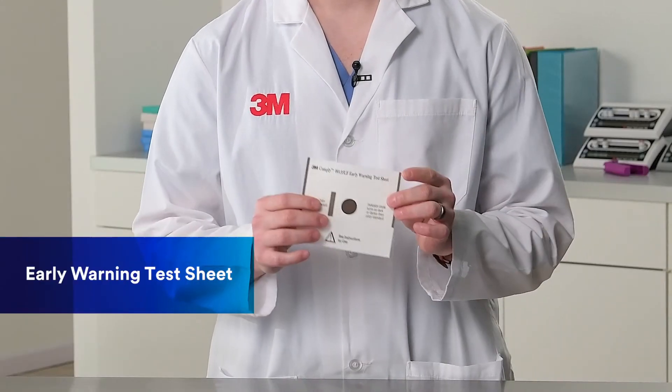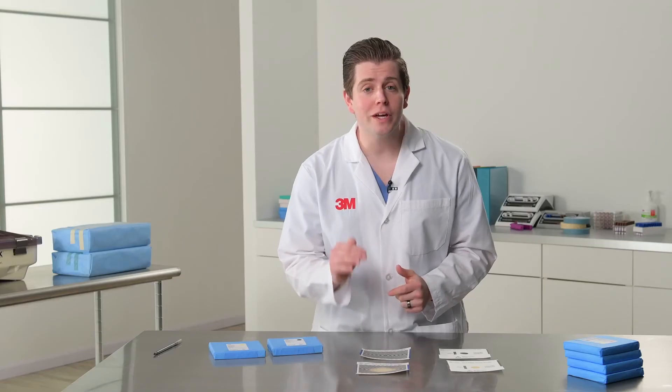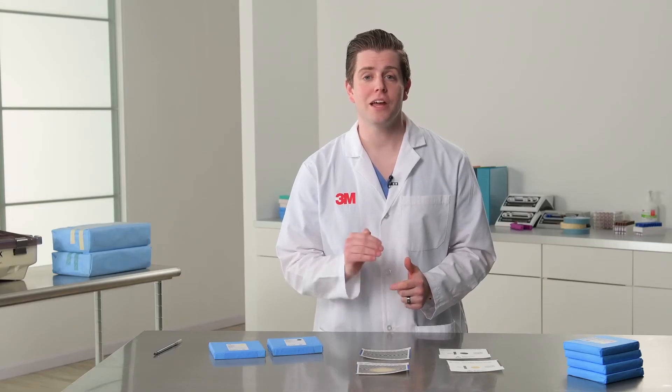Bowie-Dick Test Packs from 3M have an extra sheet — it's an early warning sheet, and it's designed to be more sensitive and placed lower in the test pack to detect air problems in the sterilizer earlier. Early detection means you can schedule maintenance at the first signs of trouble and prevent shutting down your sterilizer for the rest of the day.